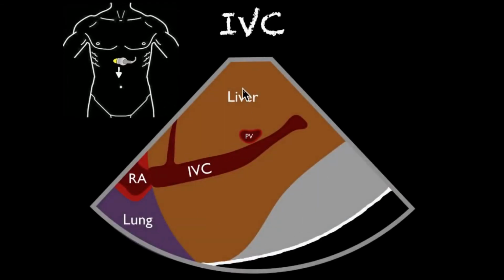And we want to see, because of this plane, because you're in the middle, you should see liver on this side. Now the IVC does course behind it, but as you go from midline over to the right, you are going to capture this right lobe of the liver behind the IVC. And another thing to help you determine this is the hepatic vein coming into the IVC.